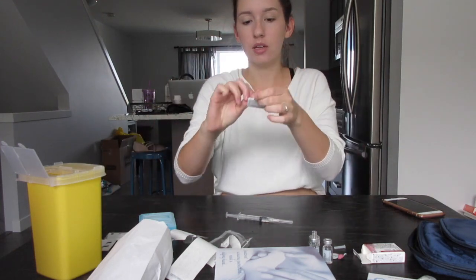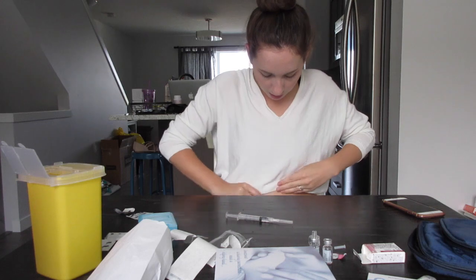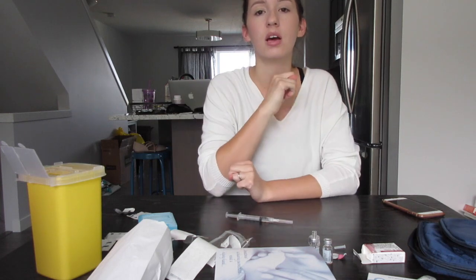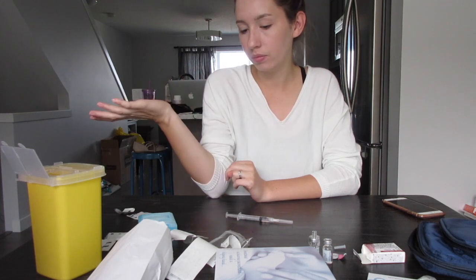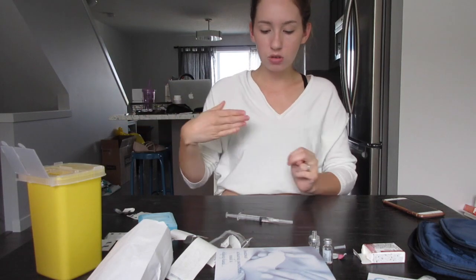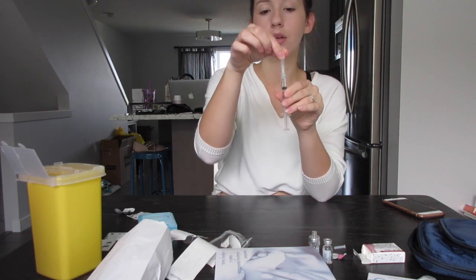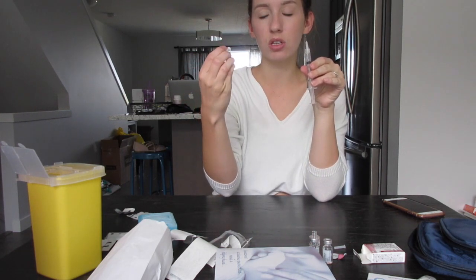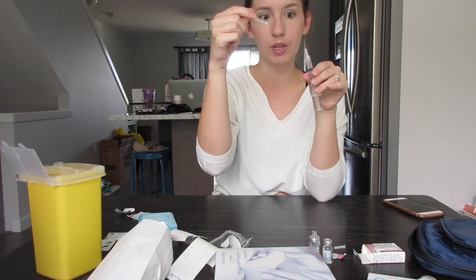What you'll want to do is get another alcohol swab and clean that area that you have chosen. I like to kind of disperse the needle sites around so that, especially if I get a bruise, I'm going in a different spot the next day. By the end of it, it's all bruised anyway, so it's not that easy, but you do what you can. Okay, so while I'm letting that dry, I am going to take off my cap. So there I have the needle. This cap is pretty small, so I usually don't try to put it back in unless I have to, because like I said, it's less accurate.